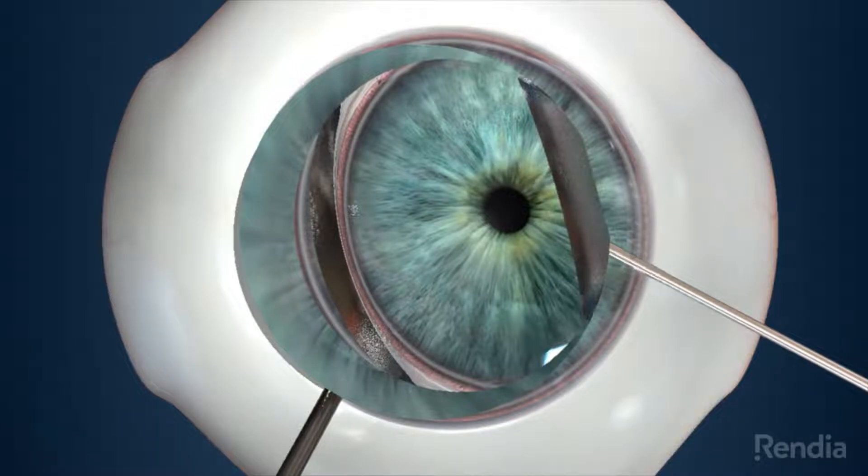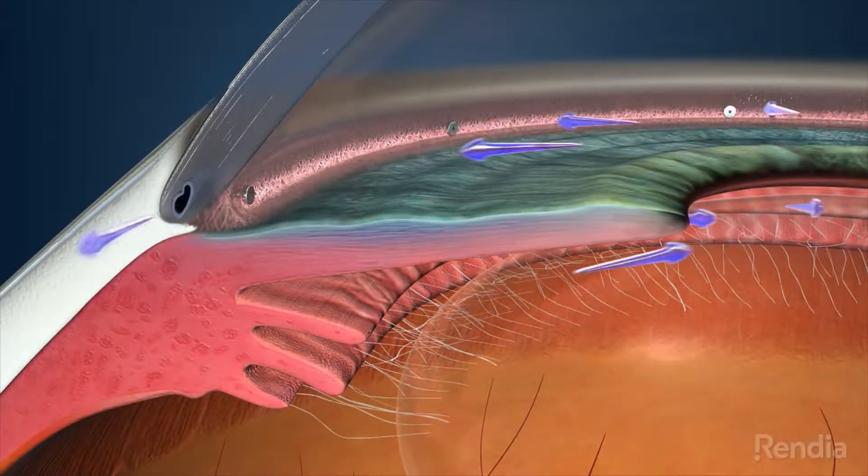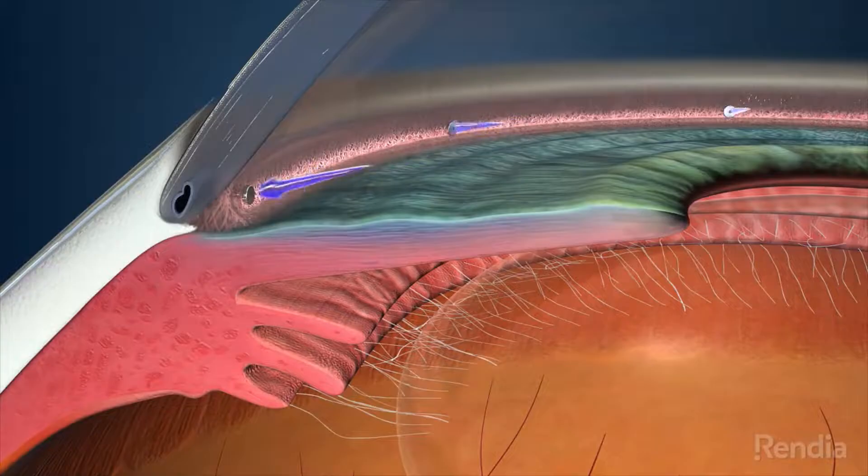This procedure is expected to last approximately a few minutes. The goal of this procedure is to restore the natural outflow of fluid from your eye. If you are interested in learning more, speak with your doctor about the benefits of enrolling in this study.